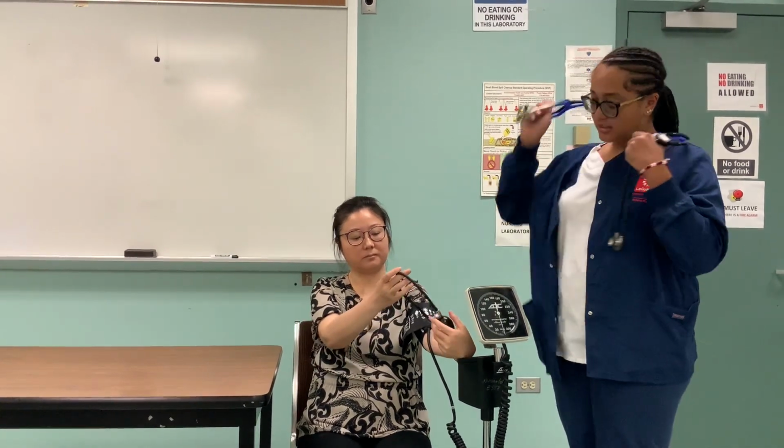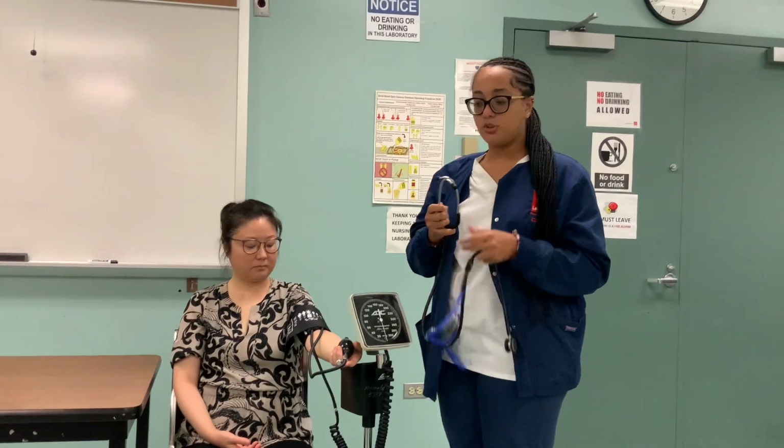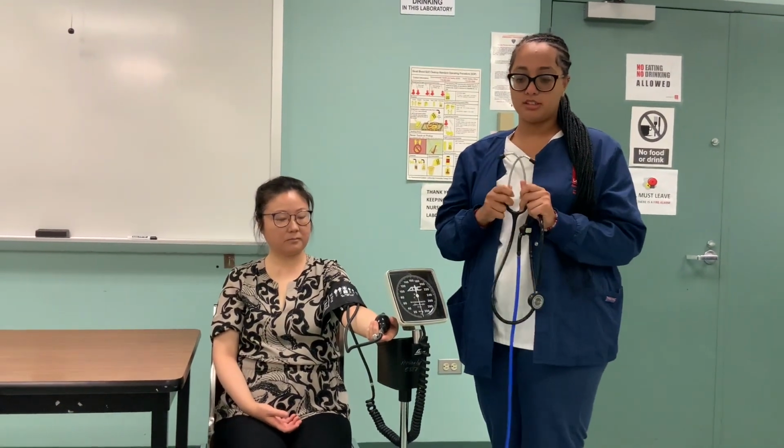But the next step, now that you have everything comfortable, would be to put on your stethoscope. And you wanna make sure that the stethoscope is comfortable because it's important for you to hear the first beat, which is usually gonna be faint. So you wanna make sure that it's on properly. So usually it has to curve in so that it's going into your ear canal.